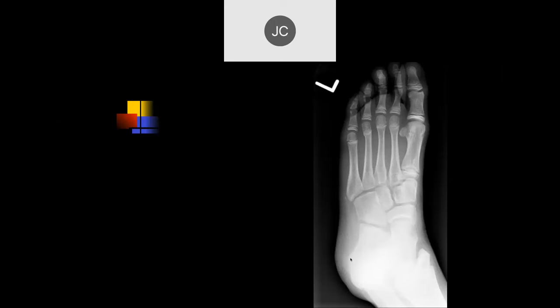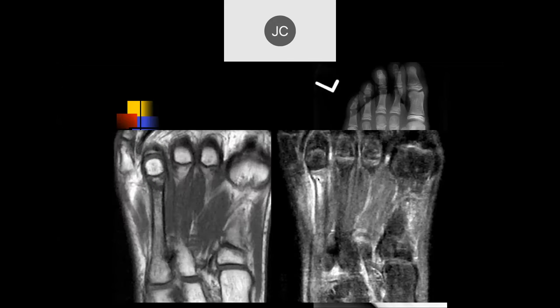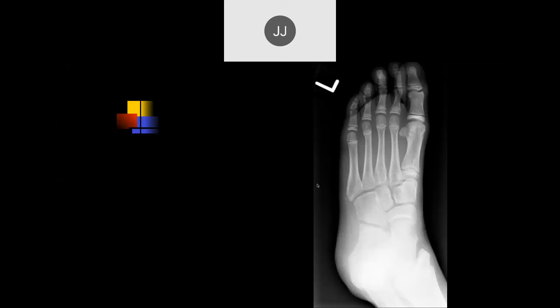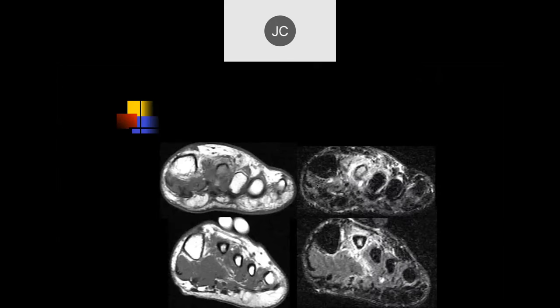Army recruits with march fractures are a classic example. Here we have a pediatric patient with a subtle cortical irregularity of the distal fourth metatarsal — a torus or buckle fracture at the distal metaphysis, which is more obvious on MRI. For a torus fracture, you would just immobilize it, maybe with a boot. It doesn't really need any treatment — it'll be fine.